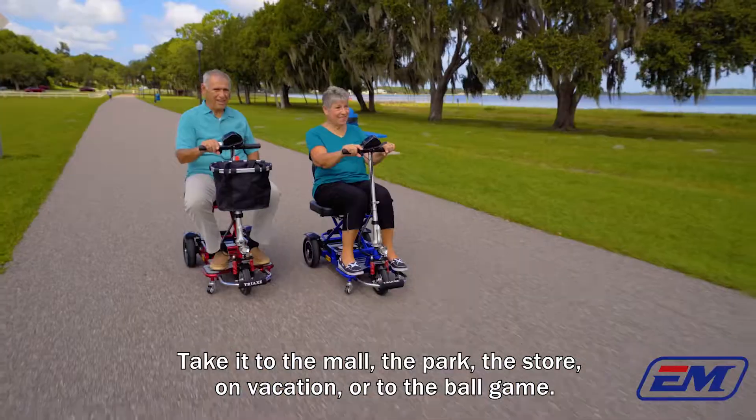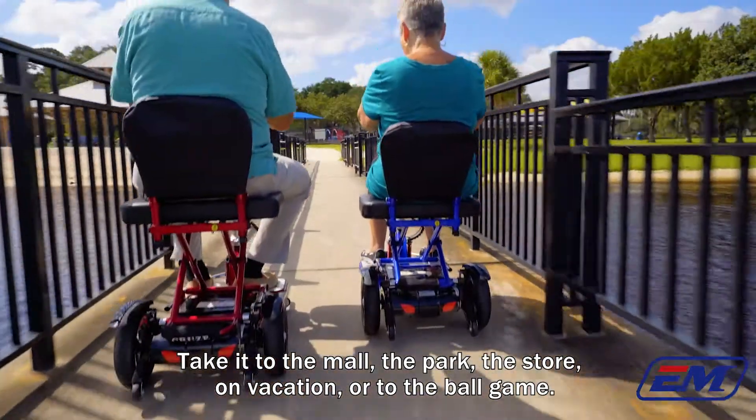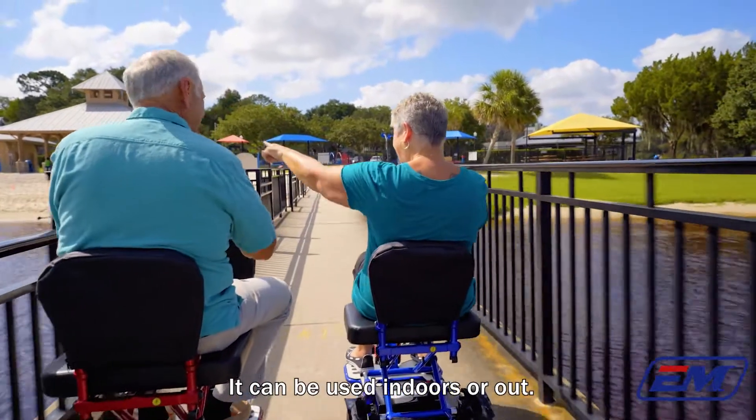Take it to the mall, the park, the store, on vacation, or to the ballgame. It can be used indoors or out.